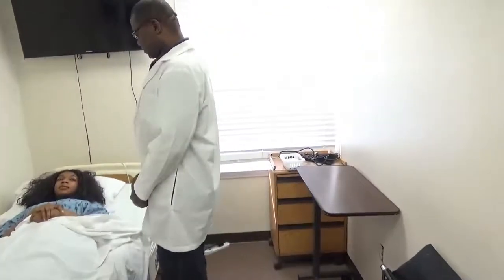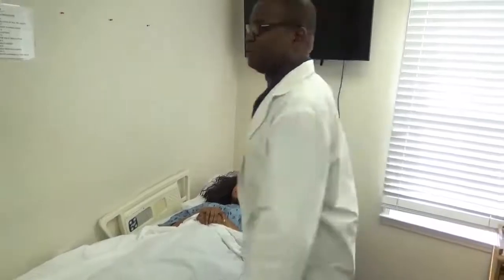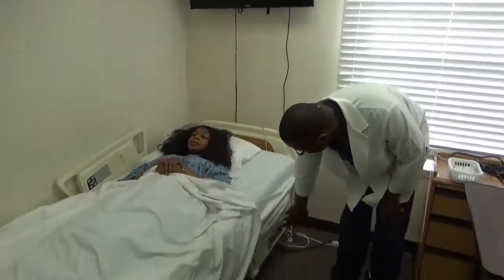Ms. Janice, next I'm going to assist you to measure your blood pressure, okay? Okay. Provide privacy. Make sure the bed is in a safe position.